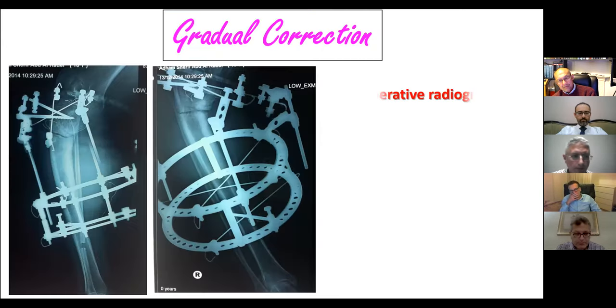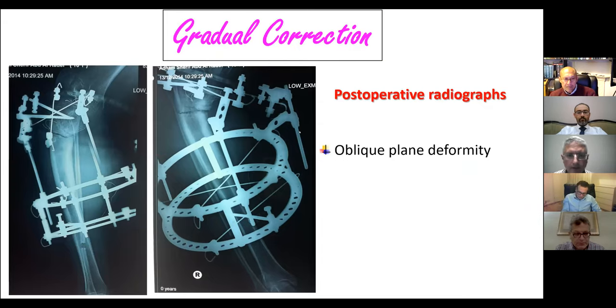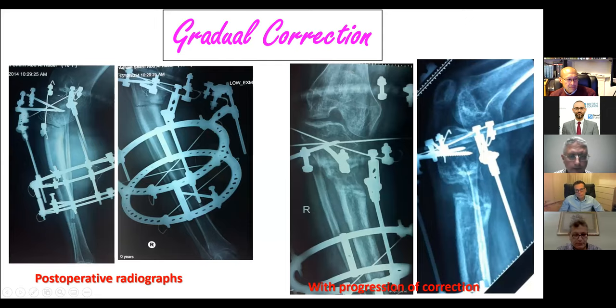These are the post-operative radiographs. Again, we are going to talk about the simple Ilizarov frame because we have some learning points to take from this case. This is an oblique plane deformity. We have only one distractor here. This is with progression of correction of the deformity.